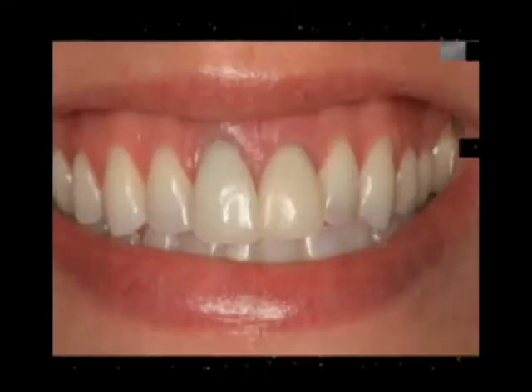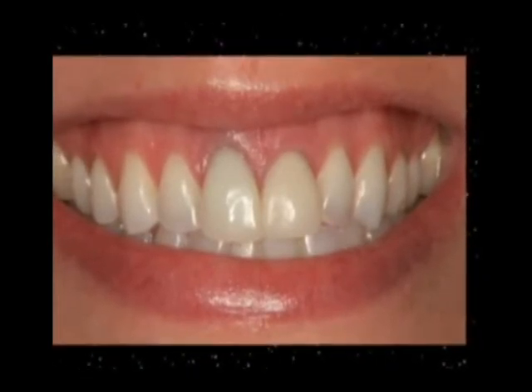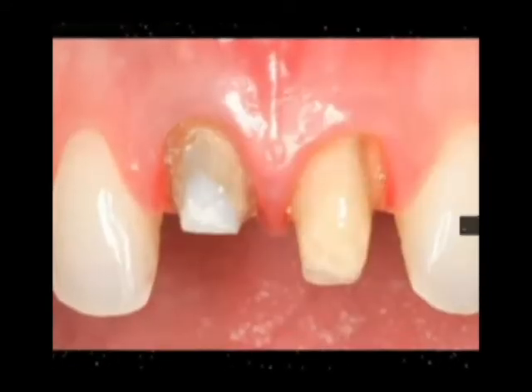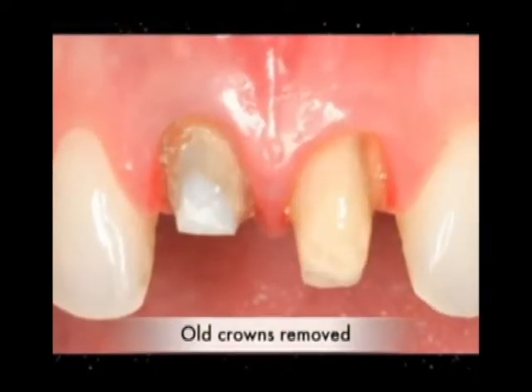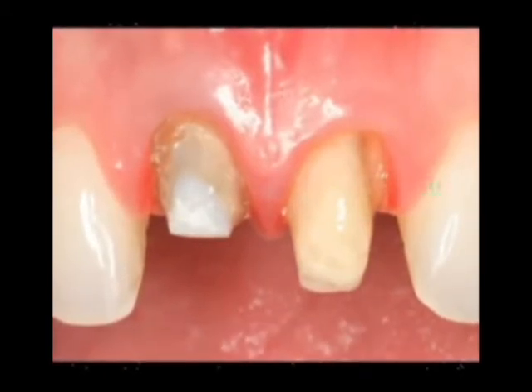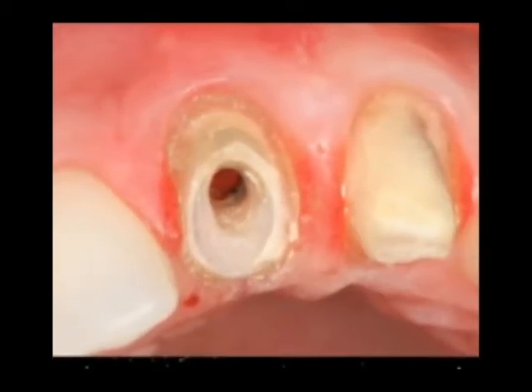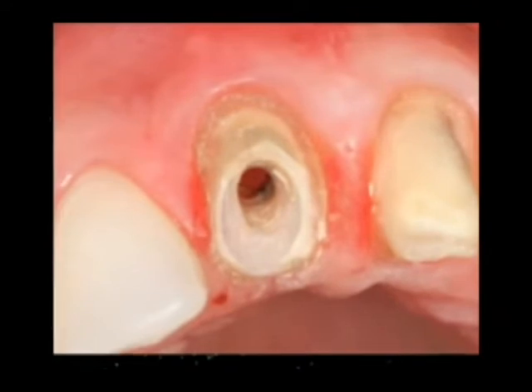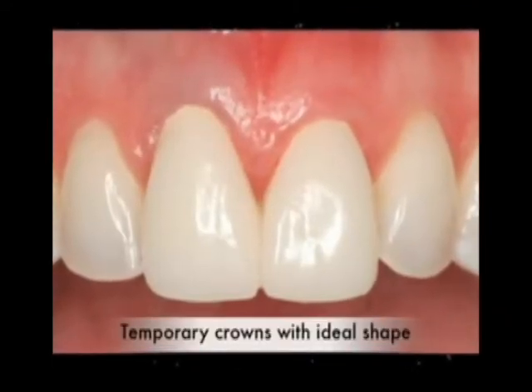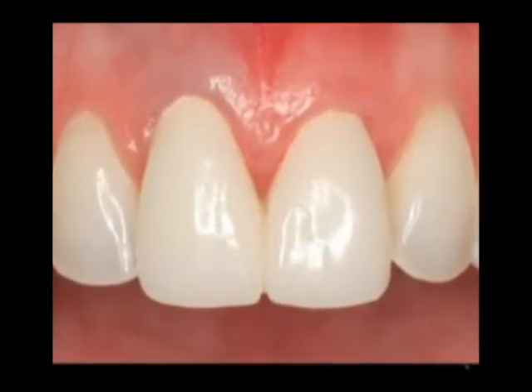So to describe the course of treatment and the steps that we took, very briefly, I'd like to show you these slides that just demonstrate the steps that we took. In this slide here, you see that we removed her old, previously placed crowns of 20 years and re-prepped the teeth and created an environment for the teeth for eventually extraction of the bad root canal tooth. But instead of extracting the tooth, we put on two nice temporaries on the two teeth. And these temporaries are what we're going to use during the healing phase of the bone and implant surgery.